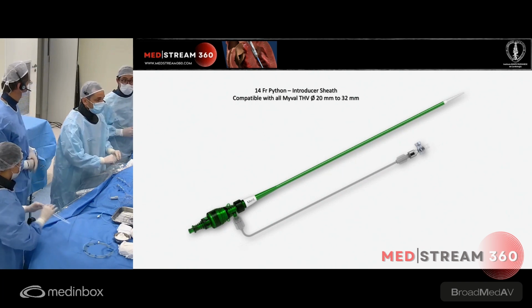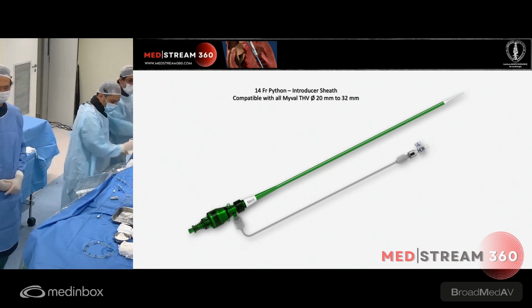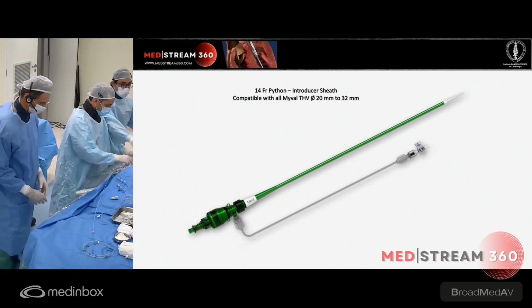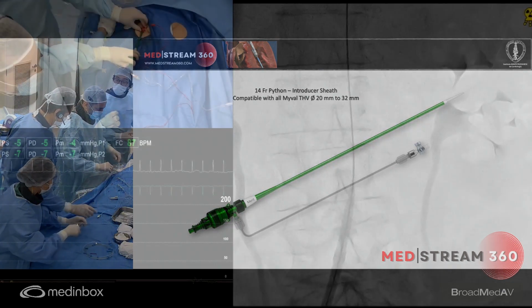Actually, it was the first case in Brazil that we did together here. Yeah, we did the first case in Brazil. We have good clinical results, low pacemaker rates, less than one digit, low PVL, and good hemodynamics.